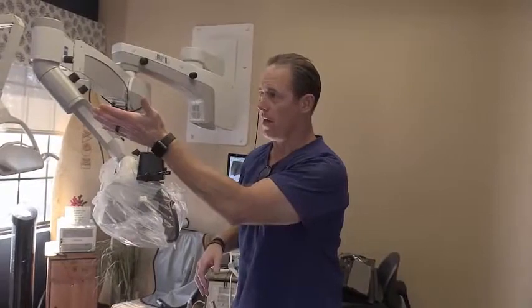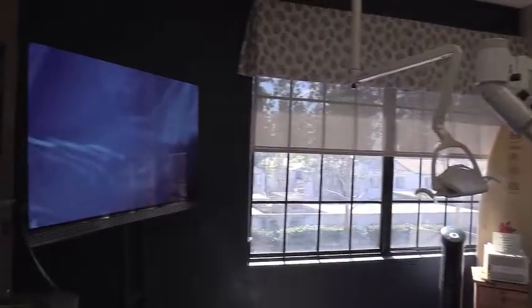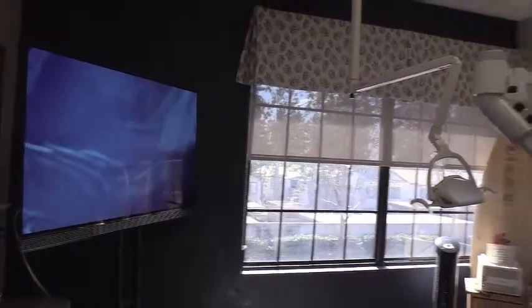I want to introduce something that's pretty new to our office — it's called the TruVision. It's a camera that you hook up to your microscope. It hooks up and shows to a TV — a three-dimensional TV. I'm actually doing my patient treatment, my root canal treatment, and my surgeries off the TV.